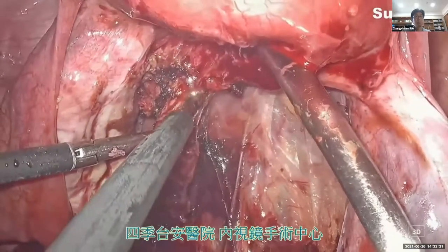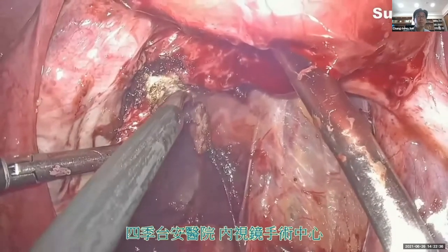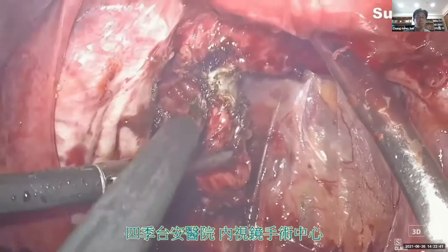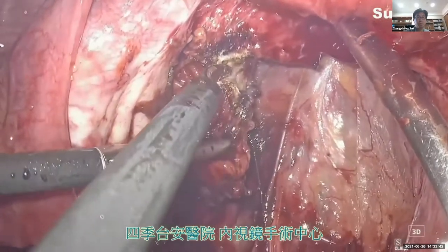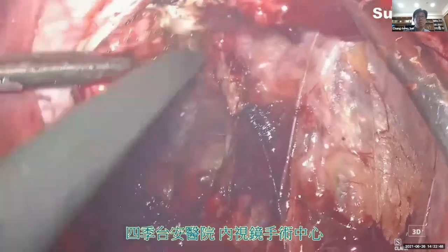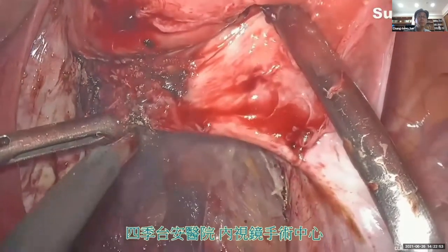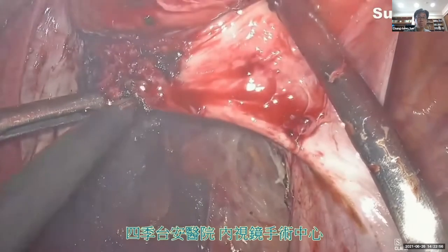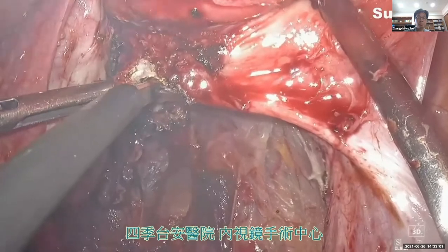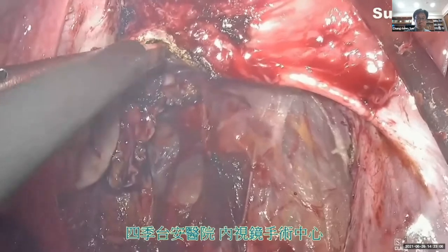Now we are approaching the posterior uterine wall, or the so-called torus uterinus, or the retrocervix area. We follow the curve of the ovarian ligament, so as not to injure the communicating branch between the ovary and the uterine vessels.